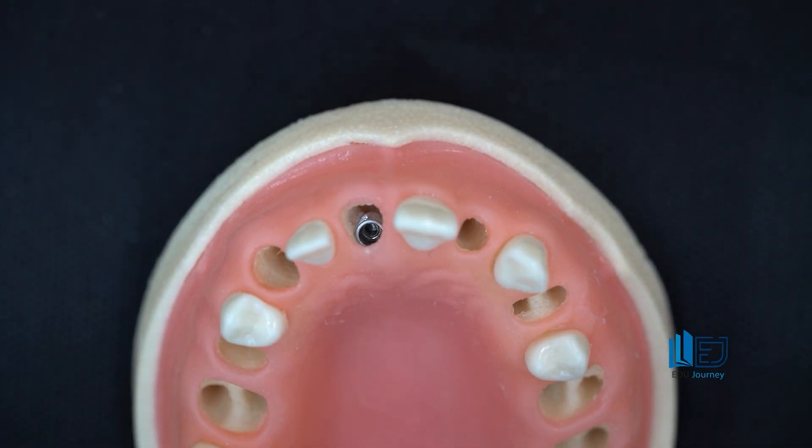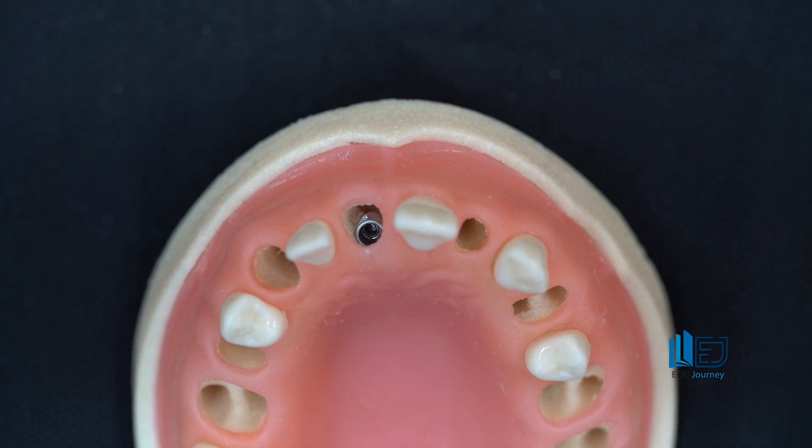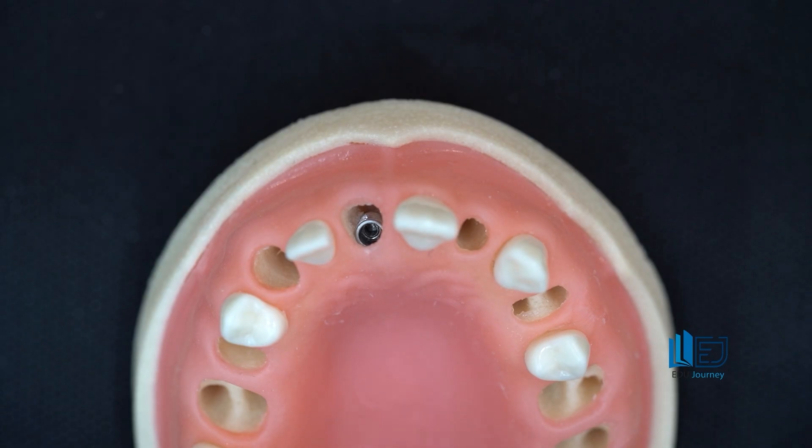In the occlusal view, you can see that the implant is completely separated from the buccal surface. This gap between the implant and the buccal surface must be filled with bone material. The old concept was that if this gap was small, you would not use bone material — don't do gap grafting; if it was large, you would do gap grafting. Considering the sensitivity regarding implants in the aesthetic and anterior region, you absolutely must perform gap grafting in this space between the implant and the buccal wall.